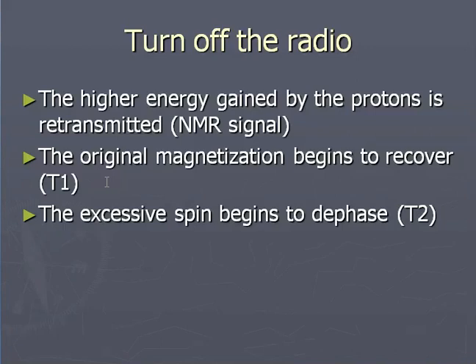The original magnetization begins to recover. The excessive spin begins to dephase because now there is no radio frequency. They try to align all the protons to the same initial condition in the presence of the large magnet.